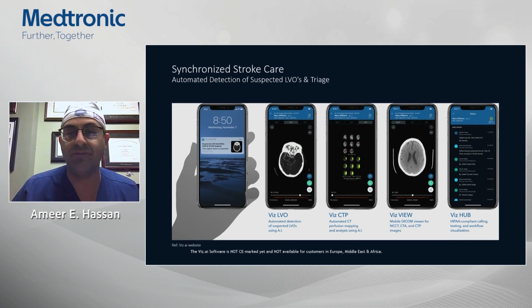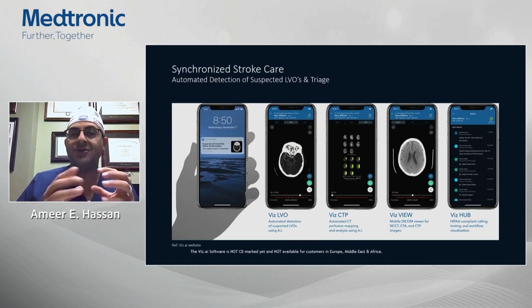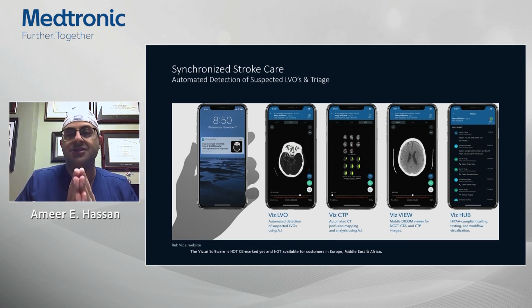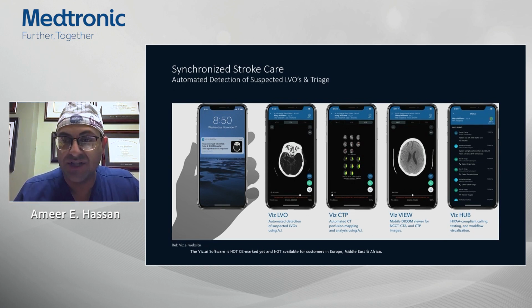To me, this is the most important piece, right? This is where my neurohospitalists at the spokes feel like they are the decision makers. They are working with us and everybody's on the same page. So we get this alert. They're looking at these images sometimes even before I do, because I'm stuck in a case or doing something else at the mothership. And they're like, hey, this is a great patient to transfer. And then the house supervisors on this group, the stroke coordinators at both institutions, the neurohospitalists, ED physicians. So everybody knows what's going on once that alert is pushed and people start messaging each other.